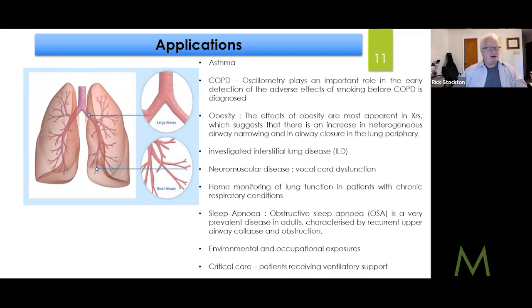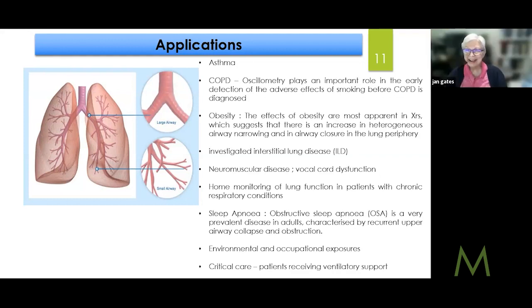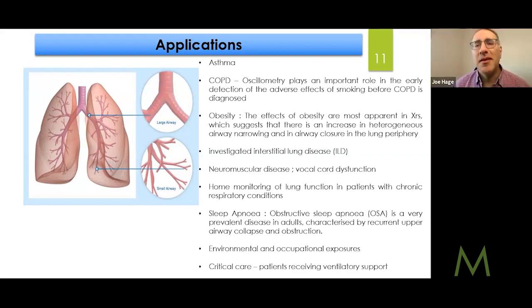If I had one of these at home and I was using it to monitor, like I would use a blood pressure device, and the arm somehow became broken, I could literally just hold it up to my face and use it that way. So it's not ideal, but as a failure mode, it's not of serious concern. We're going to continue on with undamaged product on the door, ideally. Ray, you have a comment?